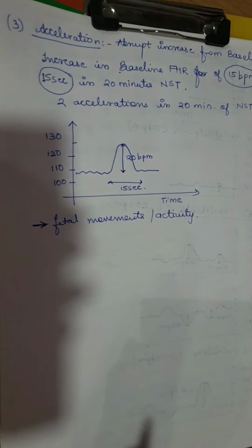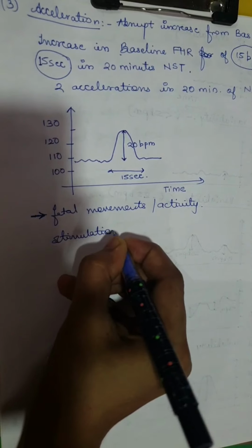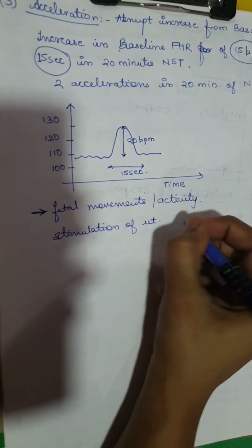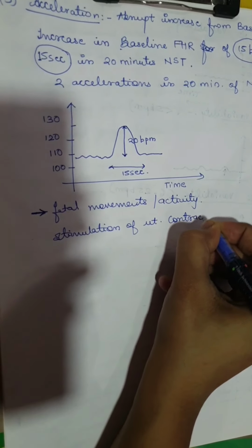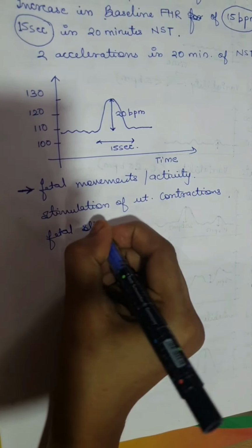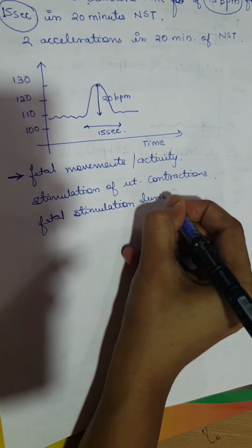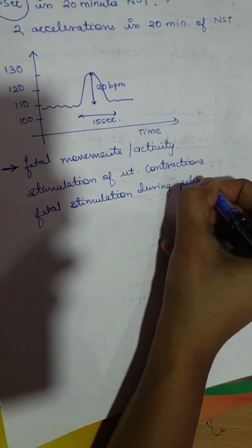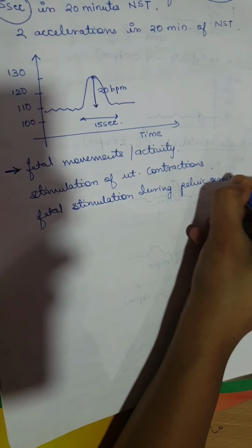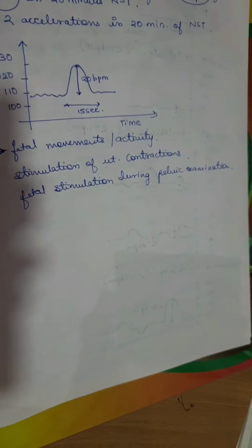Or if the fetus is stimulated by uterine contractions, or it could also be fetal stimulation during pelvic examination. So these are some causes which might result in accelerations.